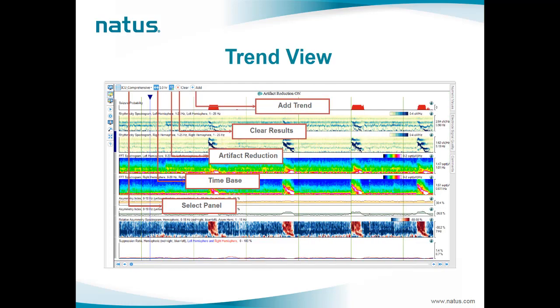The trends view shows the trends calculated offline or in real time during recording. Users can use the default template named panel in Persyst, which shows the most common and used trends in ICU. They also have the opportunity to create different templates and click on the Select Panel button to choose the desired template. Additionally, by using the same template, users can add one or more trends to the existing panel by clicking Add Trend and selecting the desired trend.